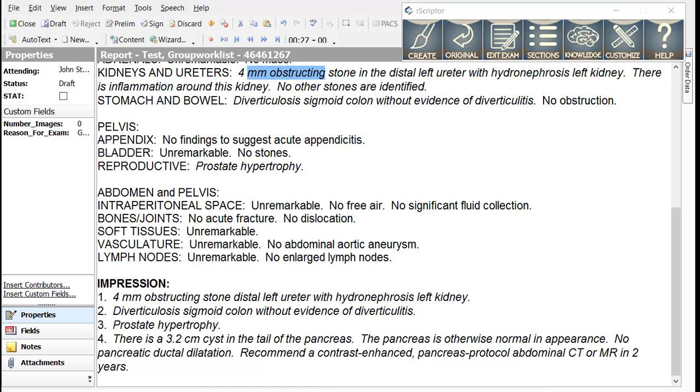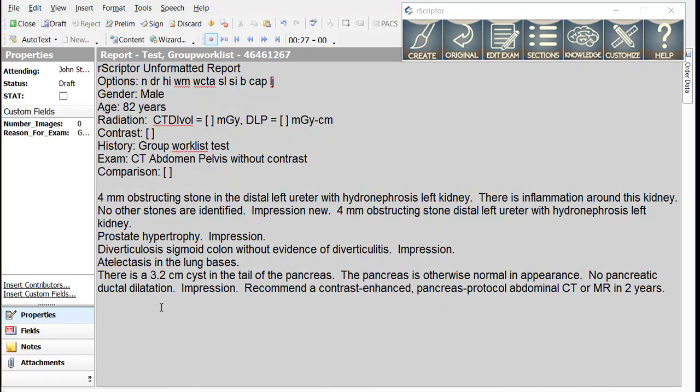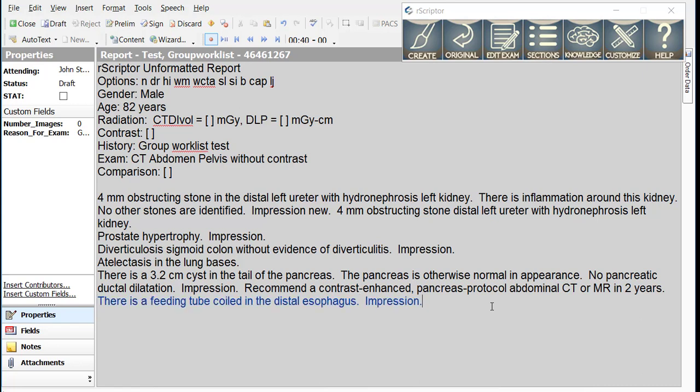Let's return to the original report and add some additional findings. There is a feeding tube coiled in the distal esophagus period, impression period. This tube will require repositioning or removal period.